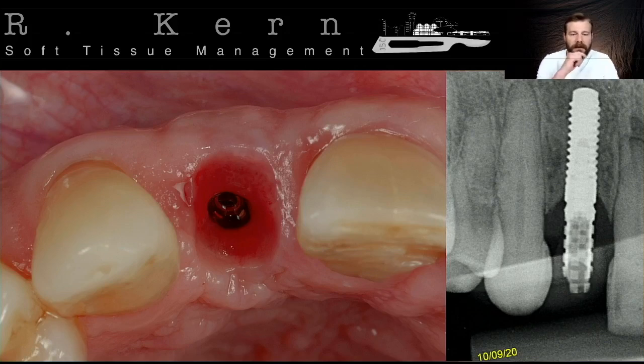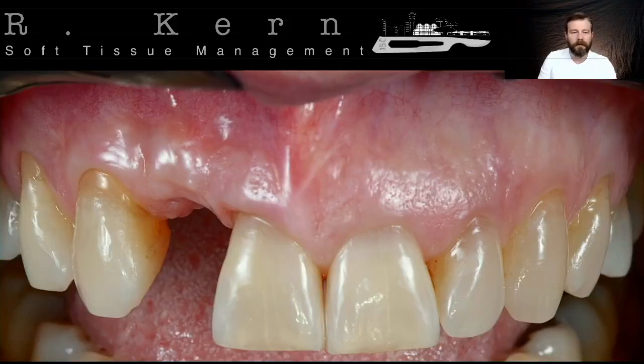Okay, in the occlusal view here, you see that there is no lack of volume. The buccal contour here is good. The problem is more vertical than horizontal. So we just remove the crown. I like to remove the epithelium inside the socket entrance from the emergence profile of this implant, because if you let it heal naturally, the epithelium takes some time to vanish, and sometimes the epithelium is still projected from inside the area.